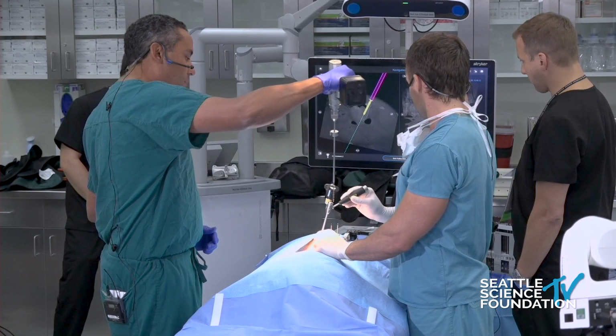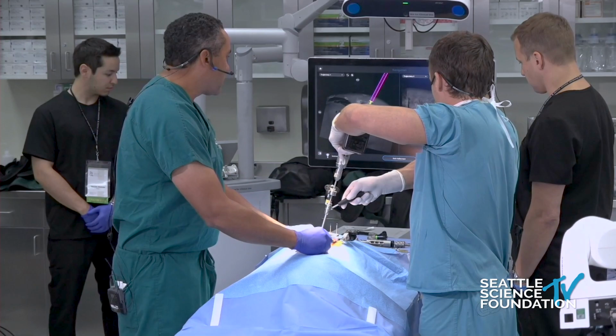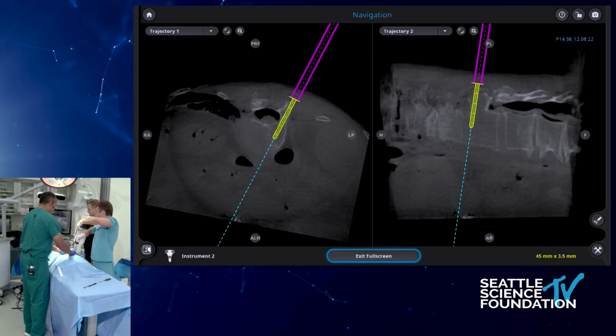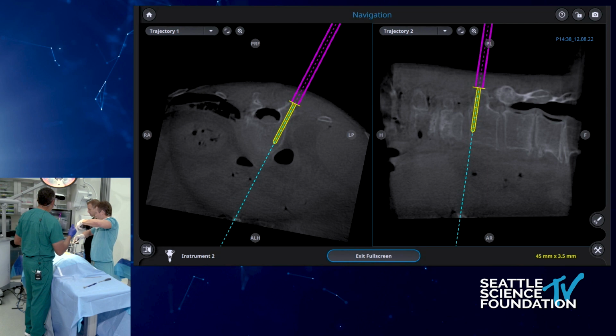And I'm going to slide this in for you. And you're going to take this thing. Hold this with your left hand. Okay? Yep. Now, you're just slightly high. Yeah, it moves. So just get that situated exactly where you want it. Now, you want to slide this whole thing down just a hair. There we go. Okay? Now you want hand towards head.